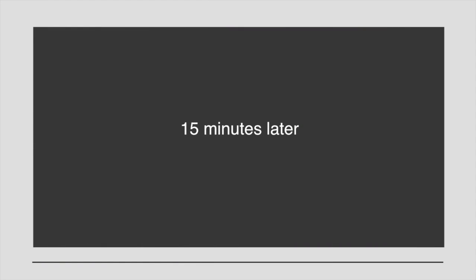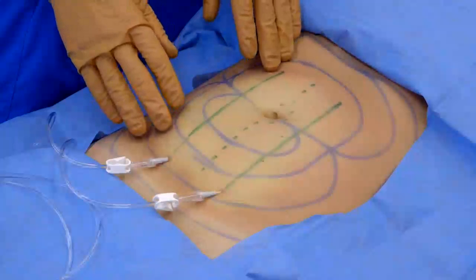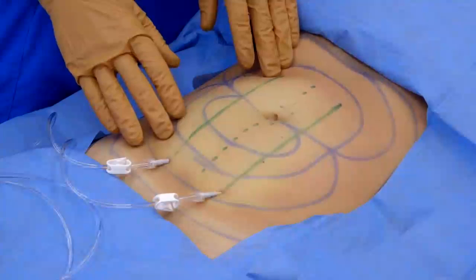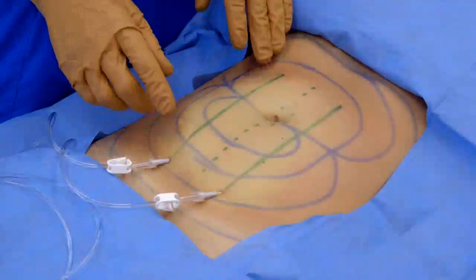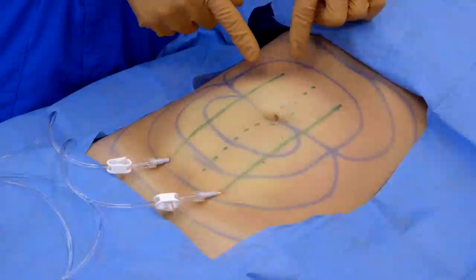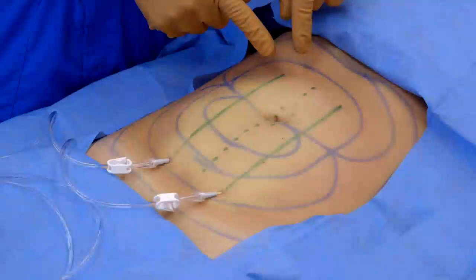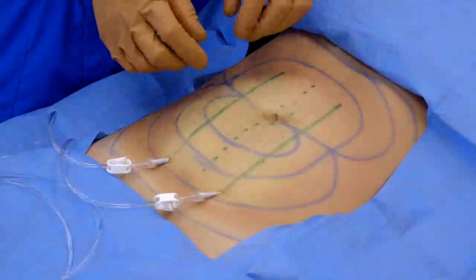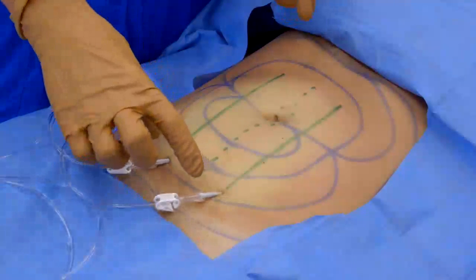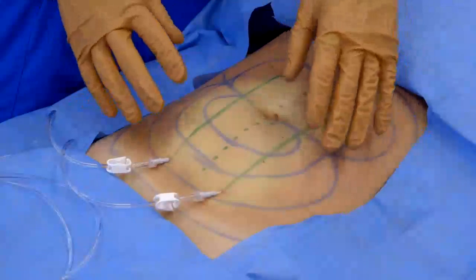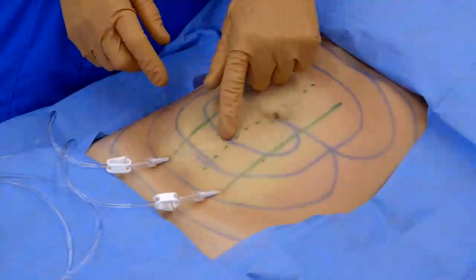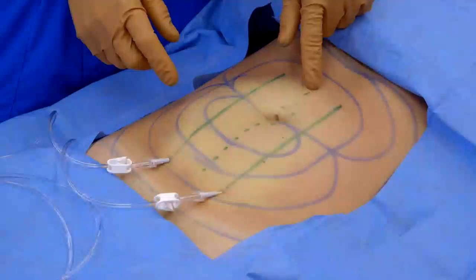It's now been approximately 15 minutes since we completed the tumescent infiltration of approximately 1 liter of tumescent antibiotic solution. You can see the rather extensive subcutaneous blanching and vasoconstriction. The blanching indicates that the antibiotic solution has been dispersed and spread both laterally and centrally, exactly where the incision will be made.